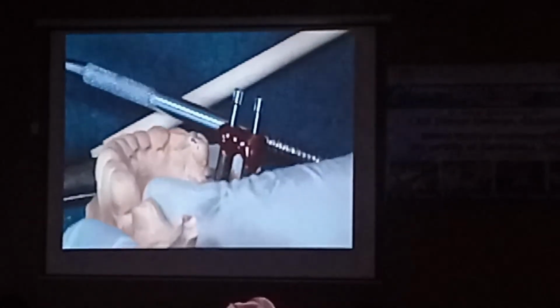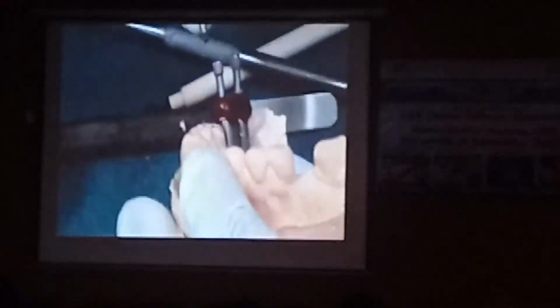Now, one way is, if I want to use it as a verification jig, what I will do is, I will allow this material to set, open the patient's healing cap, remove this jig from here, and again place it in the patient's mouth. And then I will do what? Take an IOPA here. If that seating is perfect and it is going in perfect, we call it a verification jig. So what did we verify? We verified the inter-implant positioning is right on the cast, right?